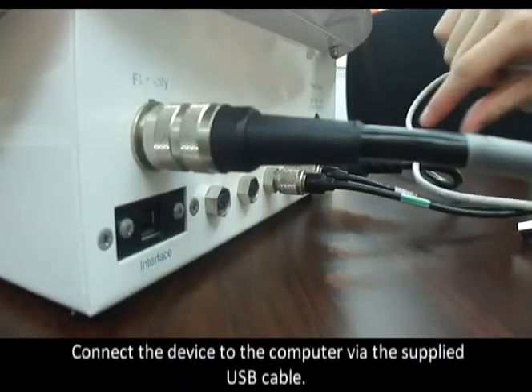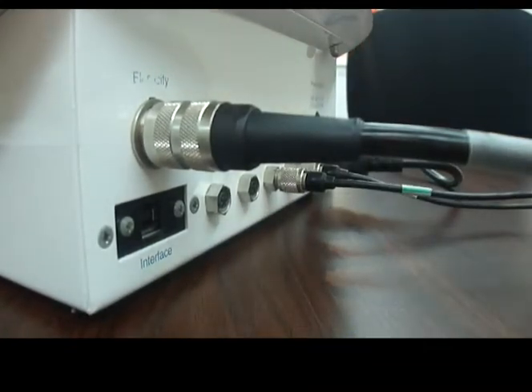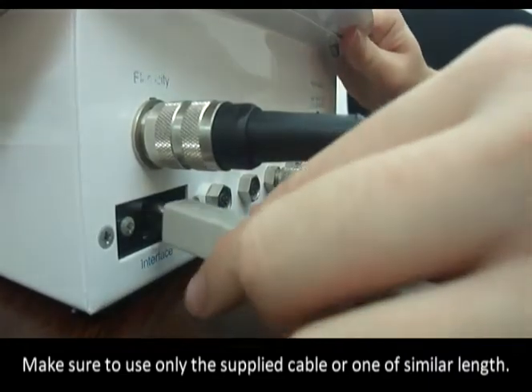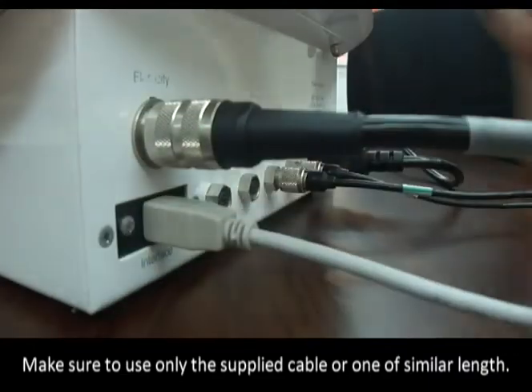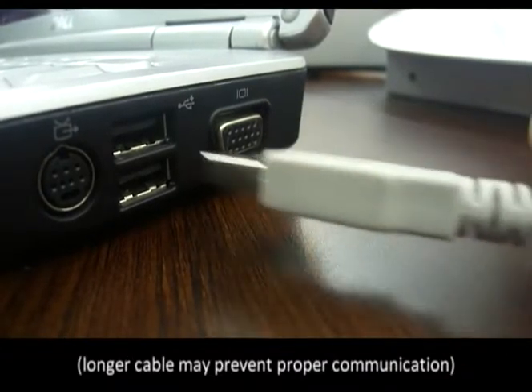Connect the device to the computer via the supplied USB cable. Make sure to use only the supplied cable or one of similar length, as longer cables may prevent proper communication.